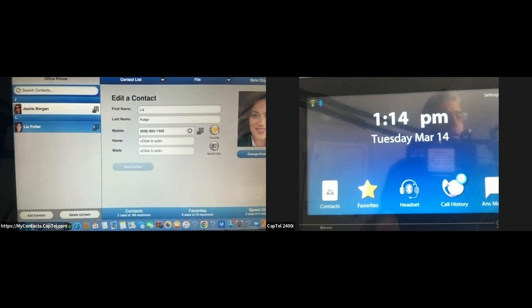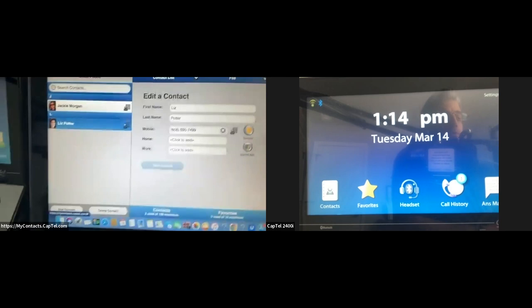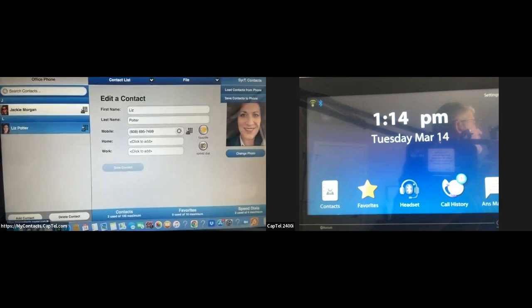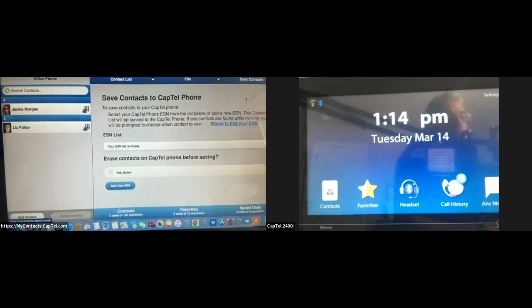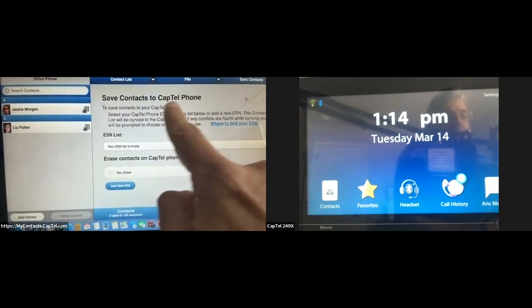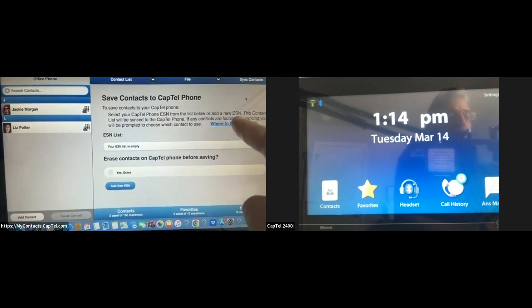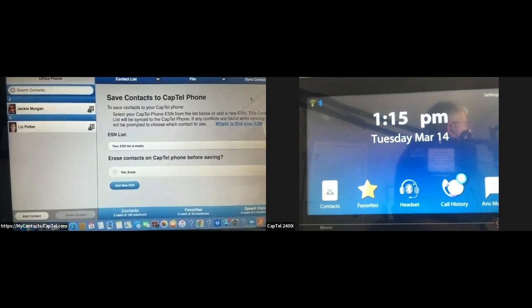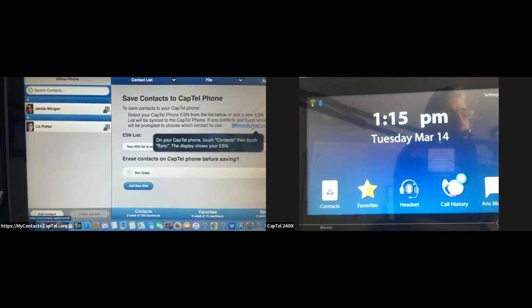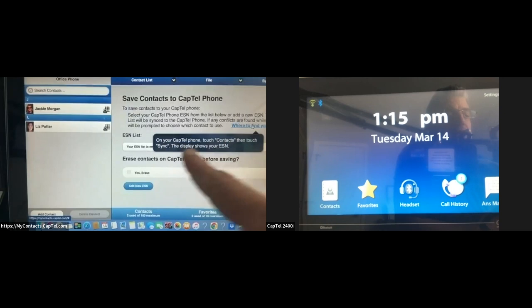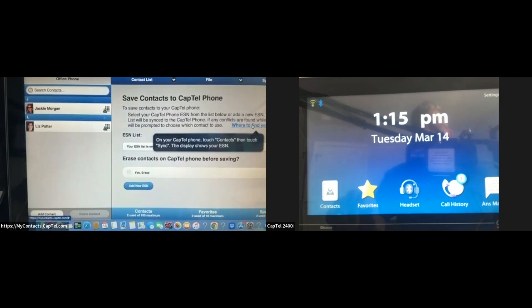Now that both names are there, I need to sync the contacts. It asks: do I want to load contacts from phone or save contacts to my phone? I want to save this information to my phone. The page advances to Save Contacts to CapTel Phone, and I need to enter the ESN — Electronic Serial Number. On your CapTel phone, touch Contacts, then touch Sync, and the display shows your ESN. My phone shows the ESN is 343G3808847.